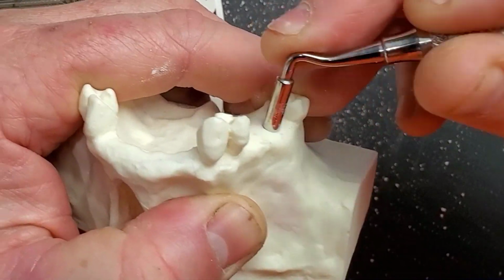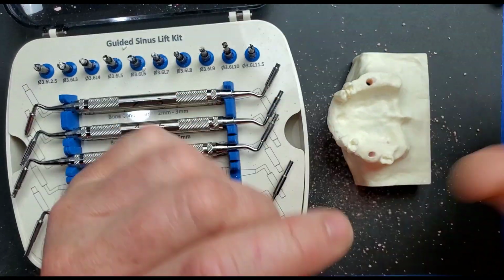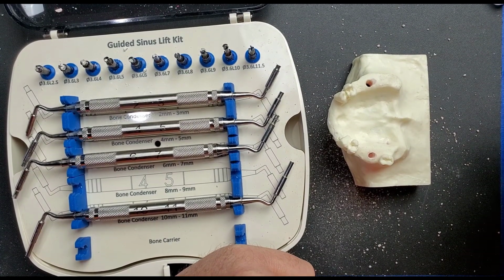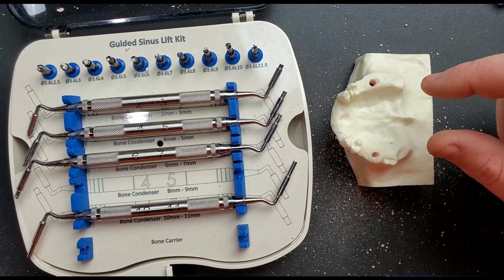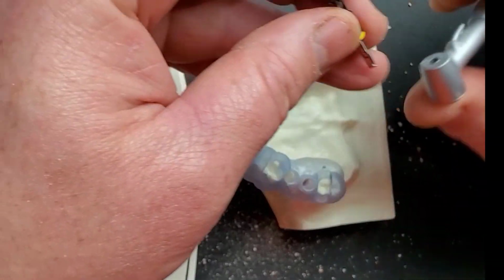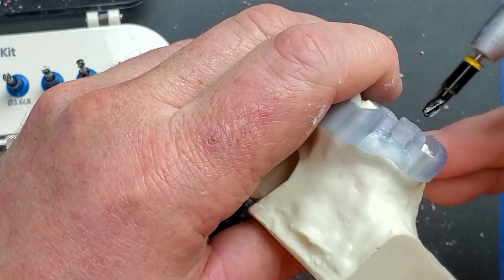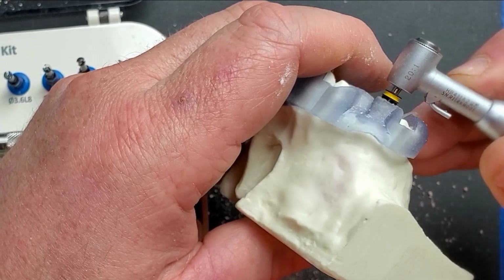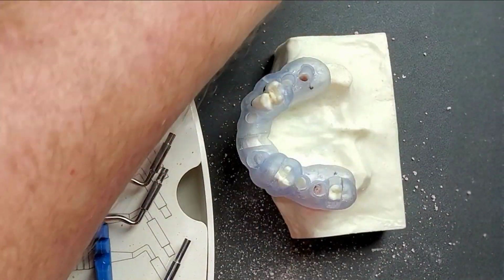Okay, so we bottomed out now. And with that complete, you would now want to come back and use your regular osteotomy drill and take it to the full depth of that bone. So remember, if we had 8mm of bone height, then I would want to go ahead and grab an 8mm final drill. So if I grab my fully guided keyless kit drills, or if you're just using your other implant system, you would just grab the final drill. And again, you're not trying to take it to the full length of the implant you're placing. Rather, you're just trying to go down deep enough that you profile the full height of the osteotomy, and the bone will condense out of the way as you go to place that.